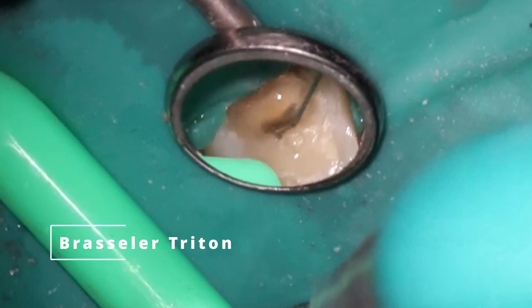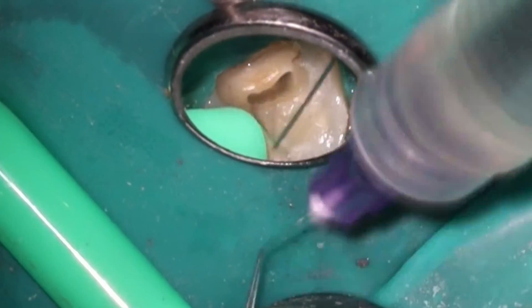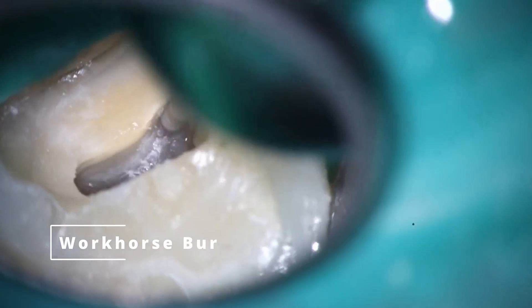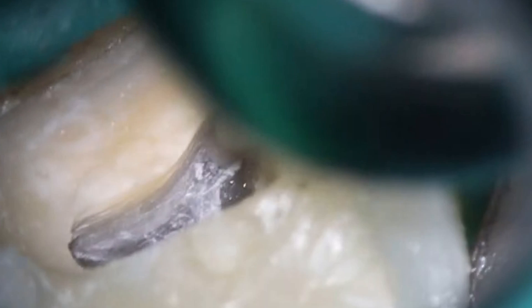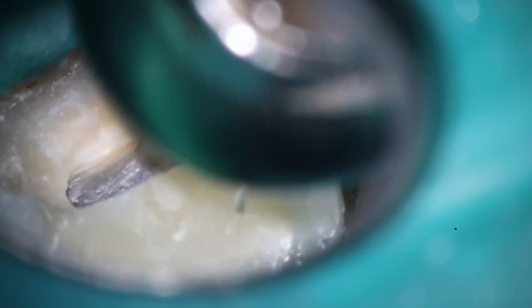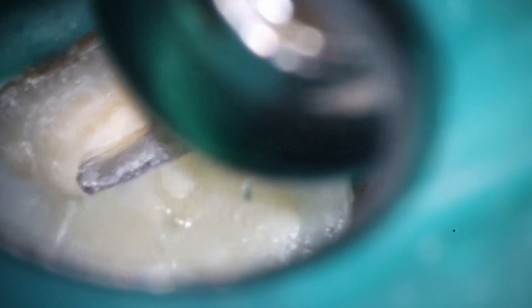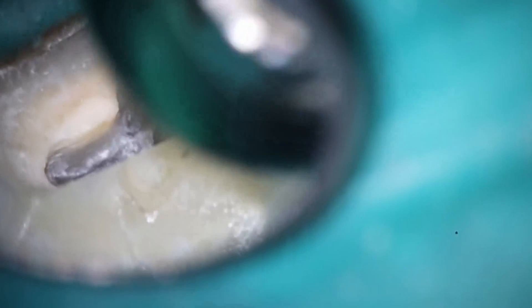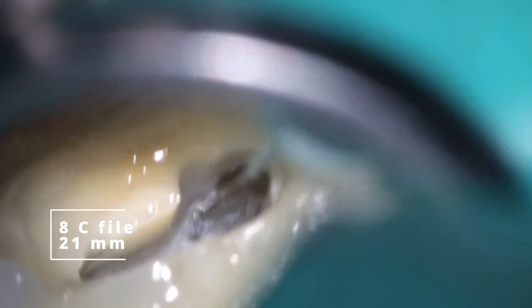It's the MB2 that gets a little bit funky, and I'm going to go through my thought process on how we work through it. I always try to hit it with the 2006 first — if I can get it into the MB2, that's fantastic, but the chances of that happening are pretty rare. I'm going to be rinsing with the Triton from Brasseler throughout. With calcifications, you don't want to be shoving more debris down there. I'm going to start troughing in a comma shape from the MB1 along towards the palatal. I can already see that spot — that's the debris inside the MB2, and that's where I'm going to be doing my troughing. For the more coronal troughing I'll use the workhorse bur — it's 0.14 at the tip, so not the skinniest but not the widest — and I like using it in the first one to two millimeters of troughing apically, mostly because it creates almost a flat surface, which makes it a lot easier to get your hand files or rotary files in there.